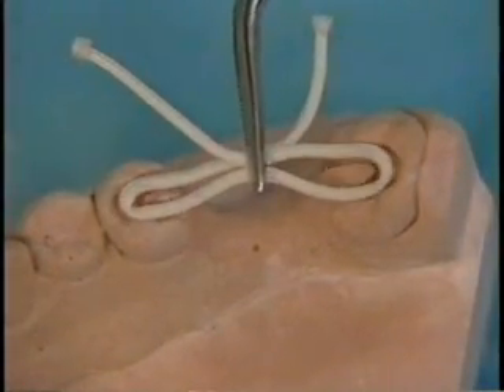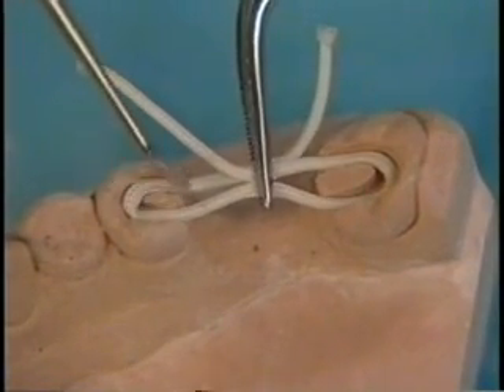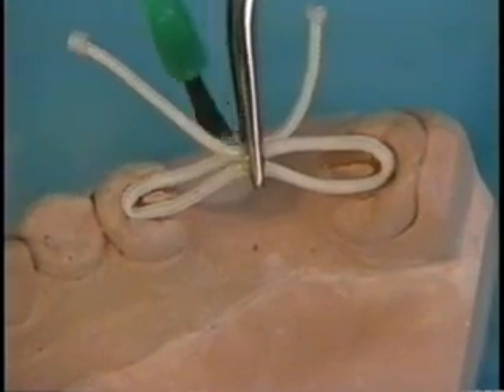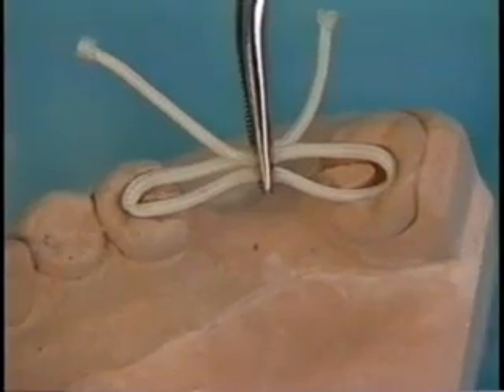Place the glassband rope into the preparations. Tack the ends together in the pontic area with a clear bonding resin, followed by a porcelain veneer luting cement or flowable hybrid composite resin, and light cure.